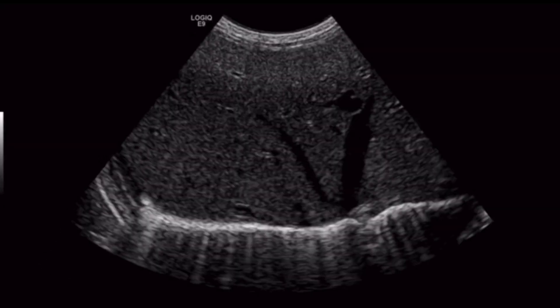The first images were taken with the 9L linear probe from the GE machine. The following images were taken with the microcurved or microconvex array, the C3-10. When scanning with the C310, I noticed that the left hepatic vein seemed a little larger compared to the middle hepatic vein. And right next to the distal portion of the left hepatic vein, there was this little cystic structure.